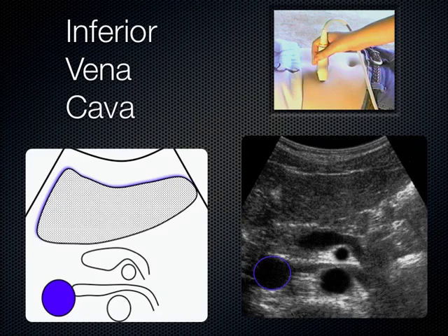Okay. One more time with the anatomy then. What's this? Good. What's this? What's this? What's crawling over SMA? Splenic vein, very good. What's this tissue out here? Pancreas. Liver. And what's getting nut cracked here? Left renal vein dumping into the IVC.